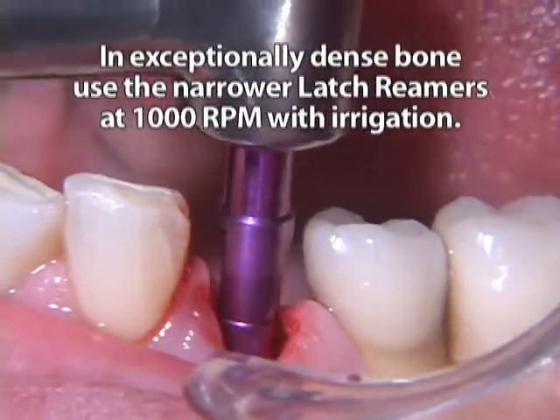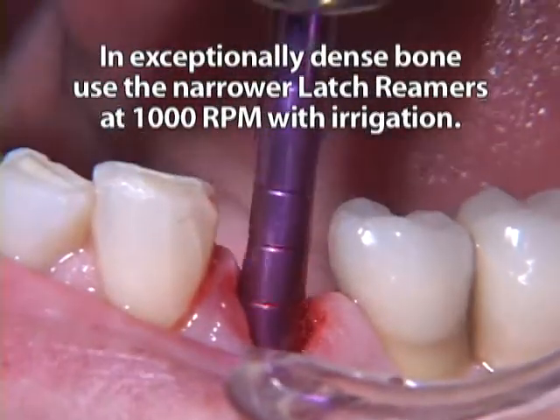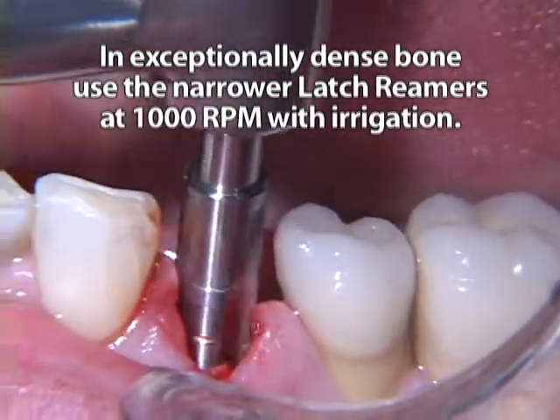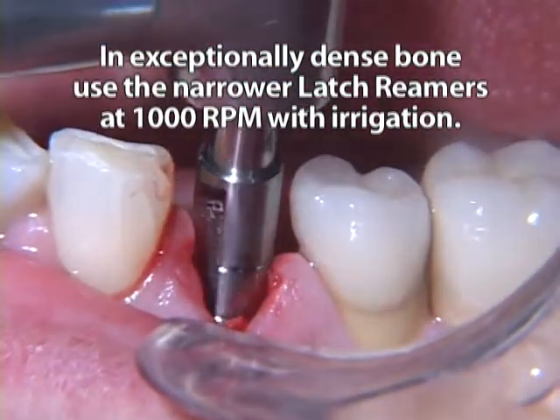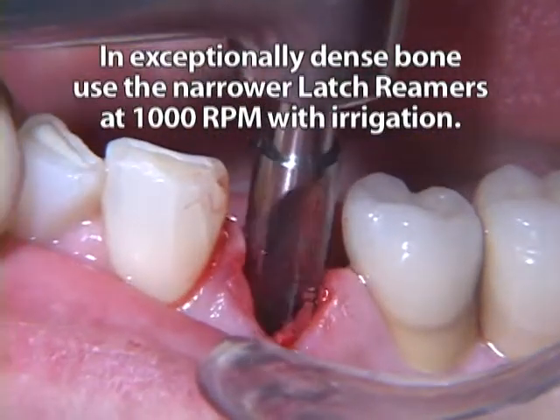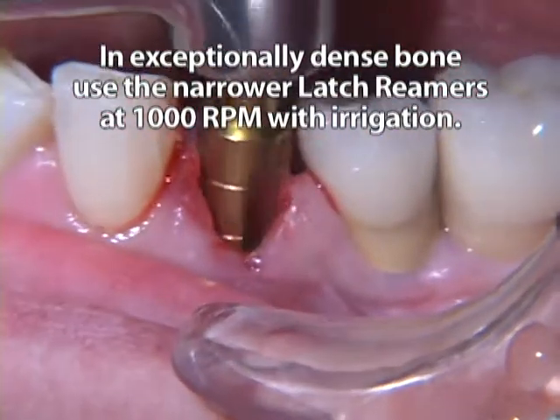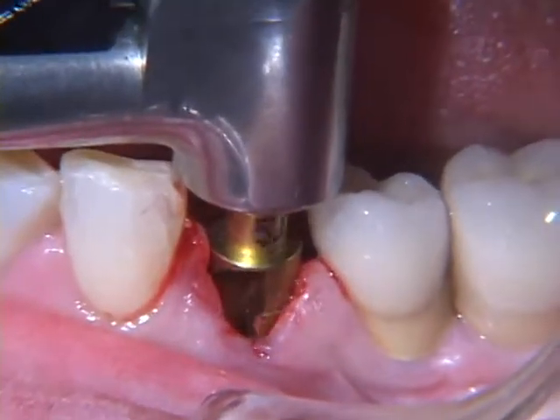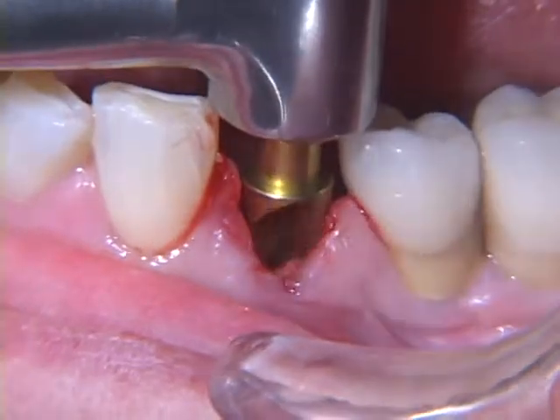However, in exceptionally dense bone, it may be necessary to use the narrower diameter latch reamers rotating at 1000 RPM with external water irrigation to achieve an osteotomy, and reserve the 50 RPM reamer burr speed for the reamer diameter of the intended implant size.